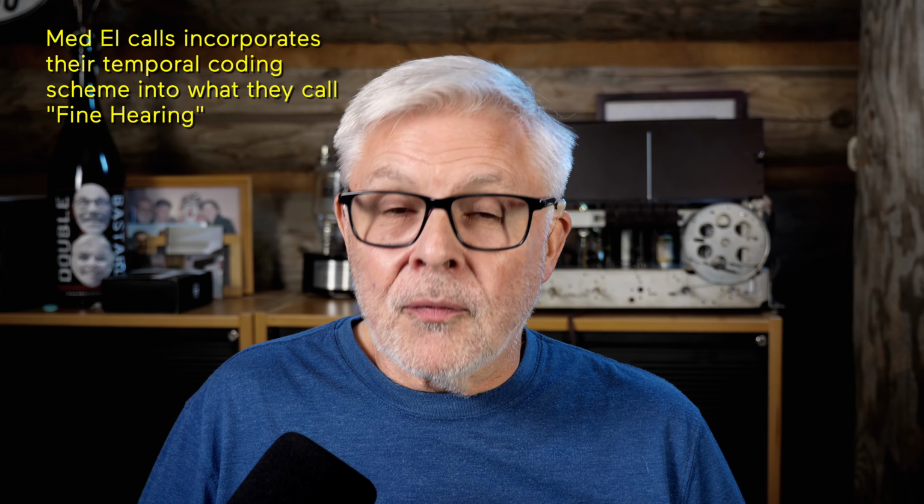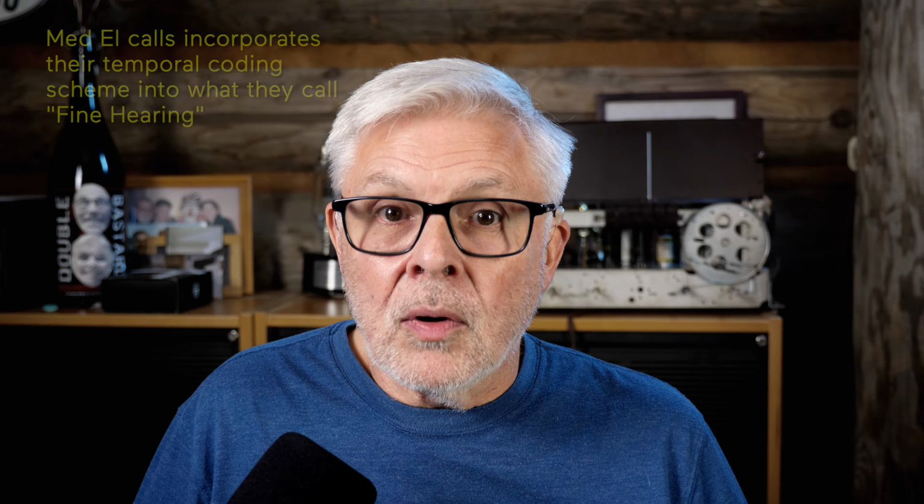In addition to place coding, Advanced Bionics, and others I believe, make use of sophisticated temporal coding schemes to let your cochlea know what frequency is being stimulated. That probably explains, at least partially, why I can discern hundreds of distinct pitches with my cochlear implant, even though I only have 16 electrodes doing the stimulating. The other explanation is something called current steering, which I've talked about in other videos and isn't super important to what I'm trying to explain right now, so we'll skip it.